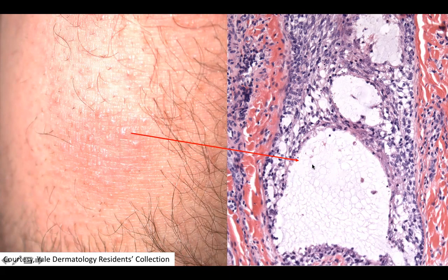Biopsy of one of these papules shows a hair follicle right here, and the hair follicle is expanded by some intercellular mucinous change with some lymphocytes as well in the follicular epithelium. Can you guess the diagnosis?